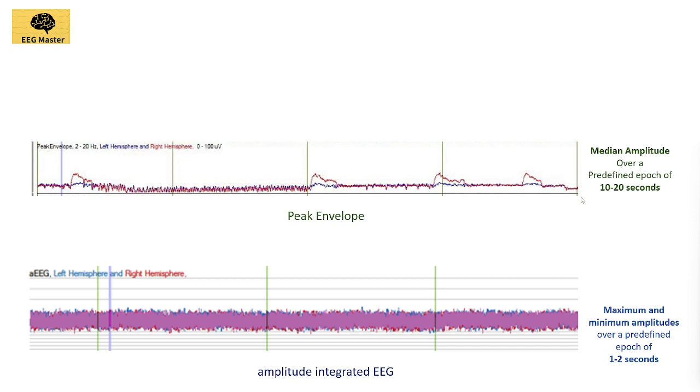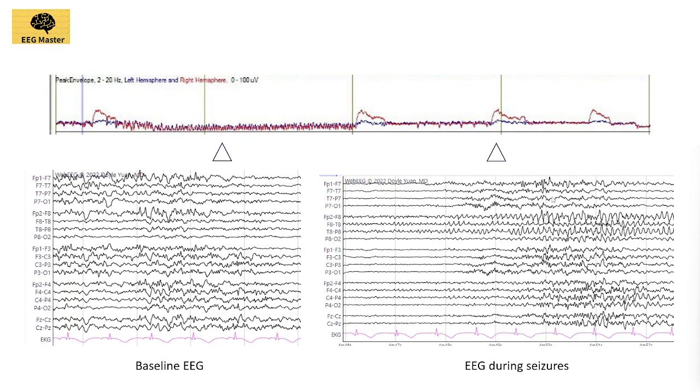For the same reason, envelope trend loses its sensitivity for smaller seizures, especially seizures that are smaller than the duration of the predefined epoch and very slowly evolving seizures. However, it can pick up longer seizures with a ramp-up and ramp-down in amplitude as seen in this picture.